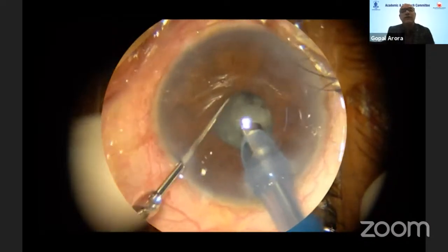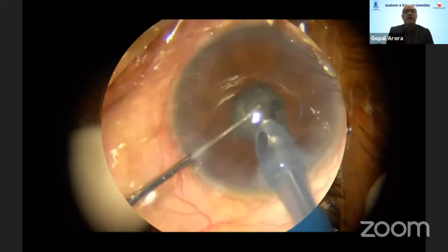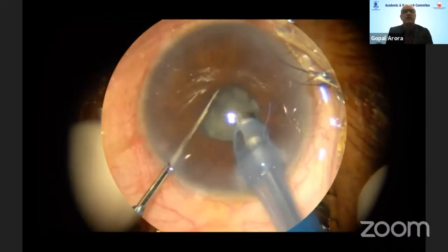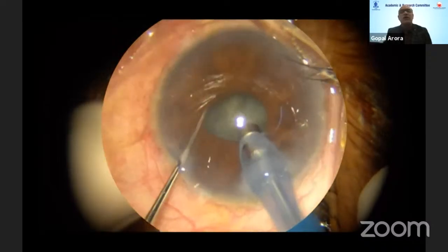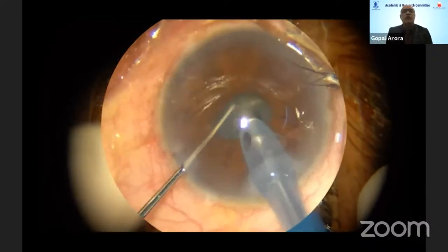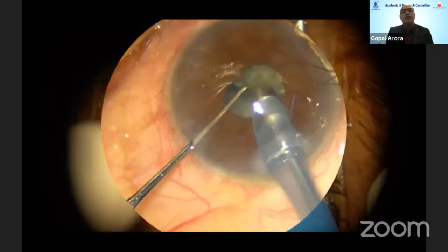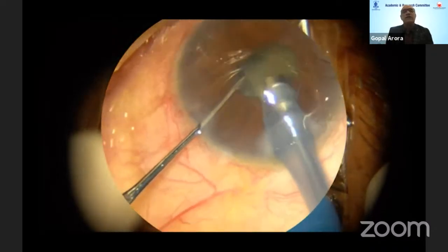The second key point which you must concentrate upon is it has to be a complete division of the nucleus, because if it's a partial division of the nucleus, again, when you are eating up the nuclear pieces, it's going to be difficult. So once you are separated into 4 or 6 pieces, you can just eat up.